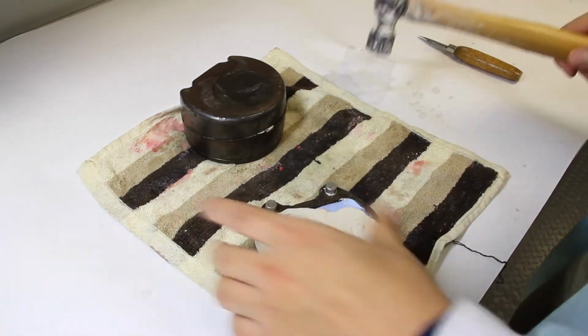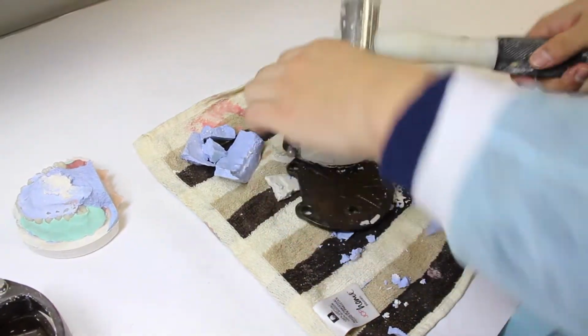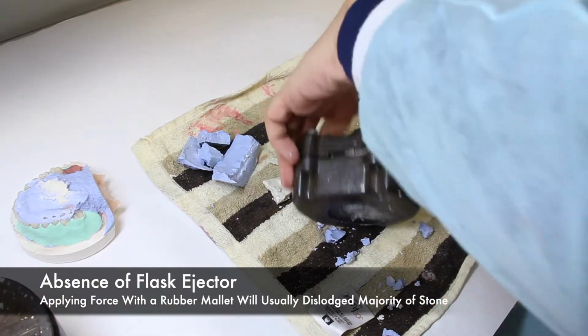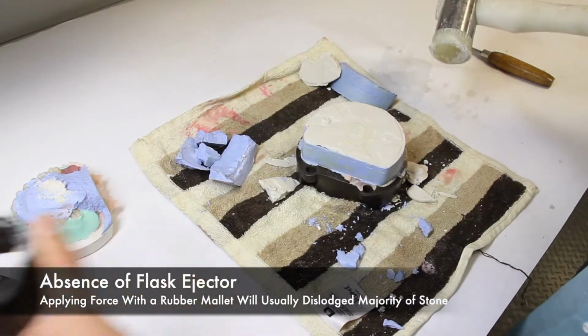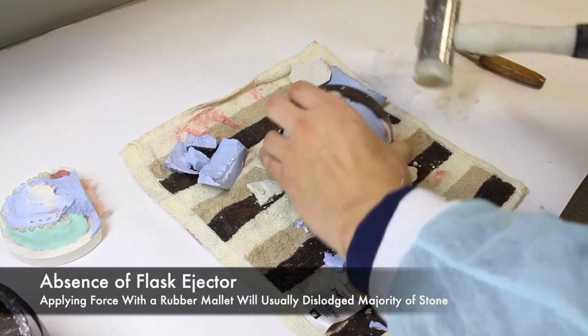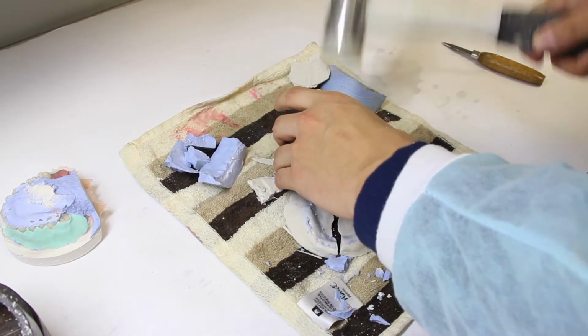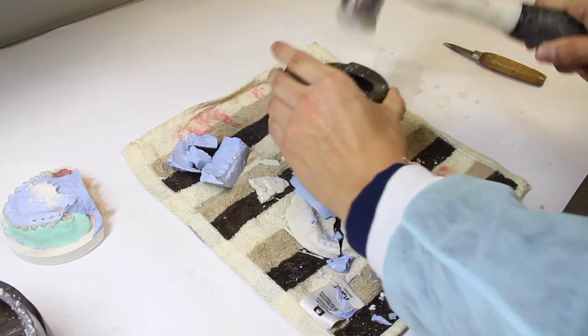In this portion of the video, you see the use of a metal hammer. It is my suggestion that you use a rubber mallet instead. This will aid in preventing damage happening to the brass flask. Strategically applying the force with the rubber mallet will usually dislodge a majority of the stone from the flask.